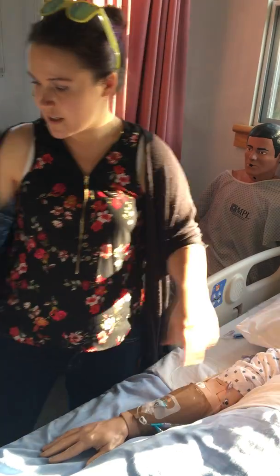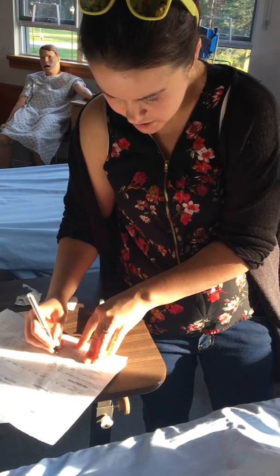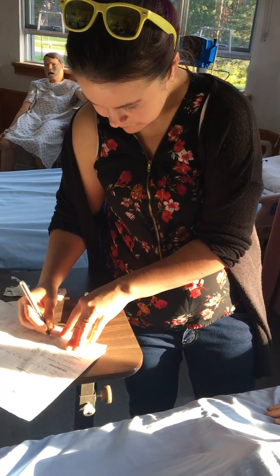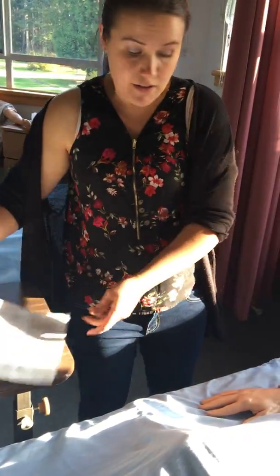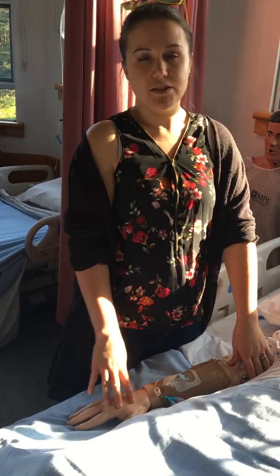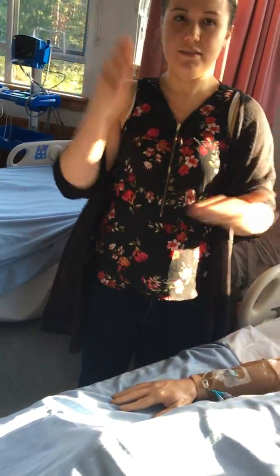I am watching my client, and I sign that I gave her this drug. And throwing this in the sharps. And then I just need to watch my client and make sure that the Narcan works, and if not, I can administer another dose. Okay, and that's it, cut.